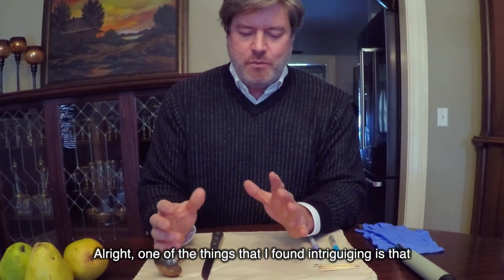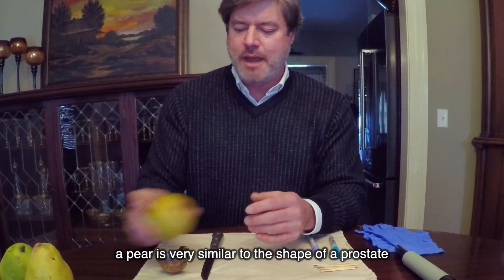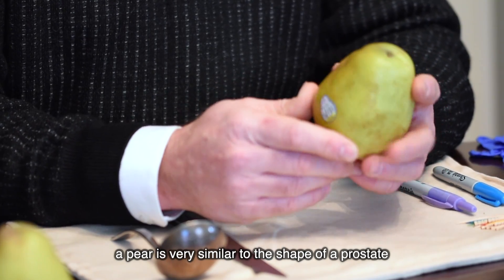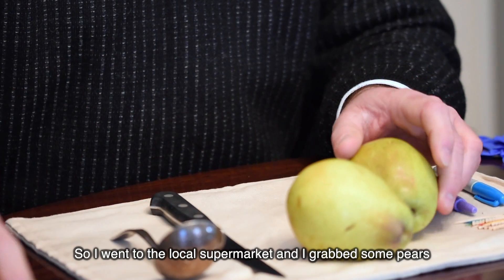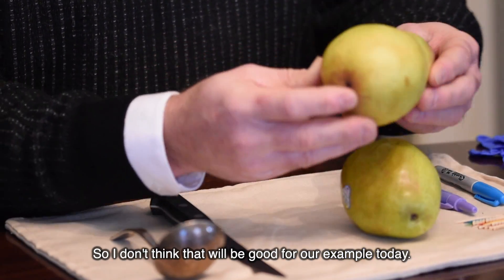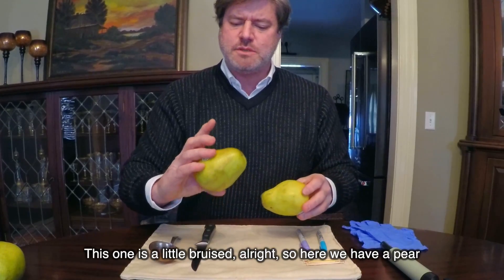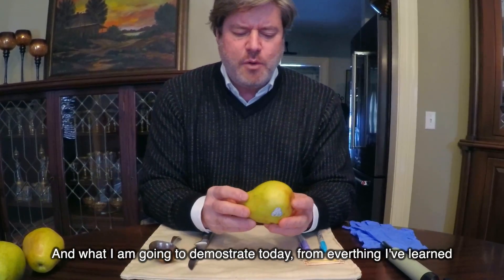One of the things I found intriguing is that a pear is very similar to the shape of a prostate. I went to the local supermarket and grabbed some pears. This one's a little too round, so I don't think that'll be good for our example today. This one looks pretty perfect. This one's a little bruised. So here we have a pear.